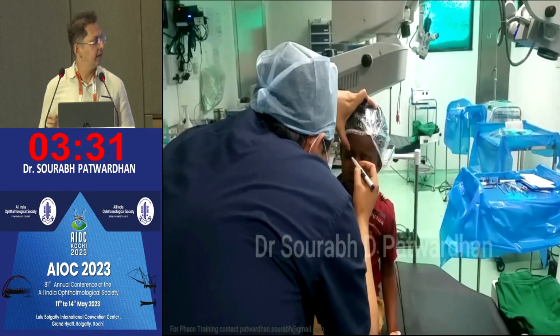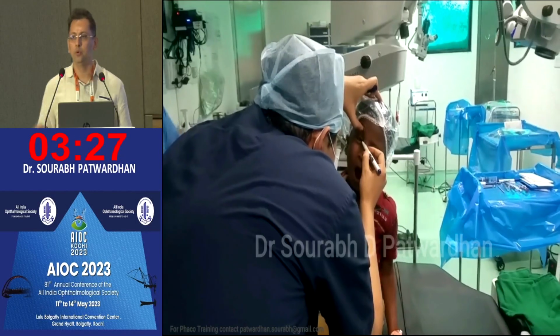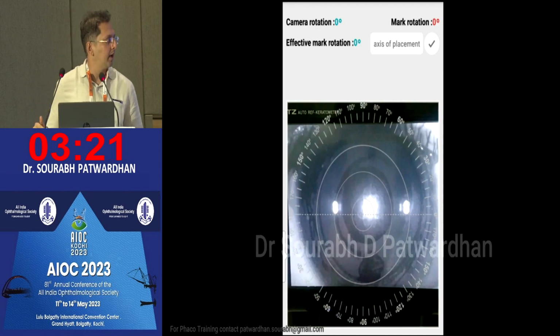So this was an interesting case. A young boy, I think 5-6 years old, with very high astigmatism, almost 4 to 5 diopters of astigmatism. So I wanted to correct that, but how to mark these young boys? At that time I didn't have a markerless system.